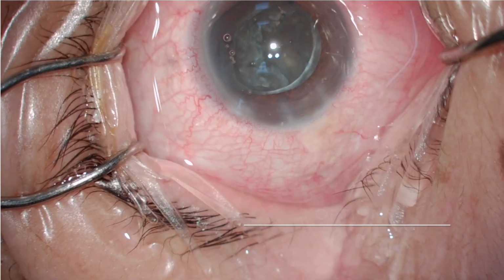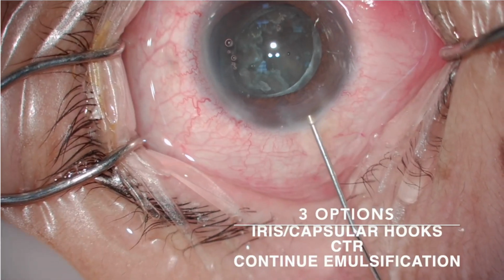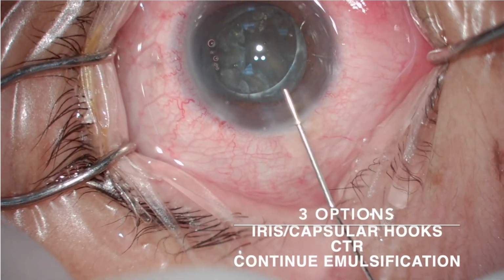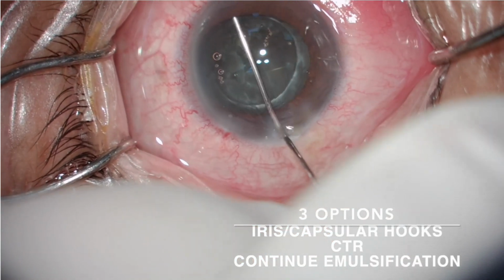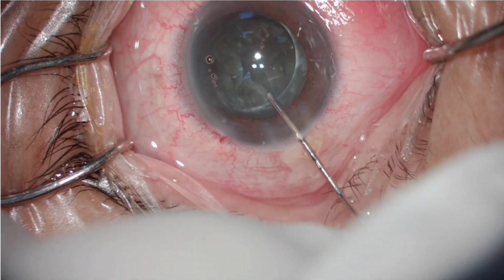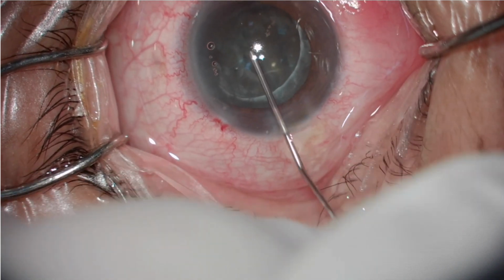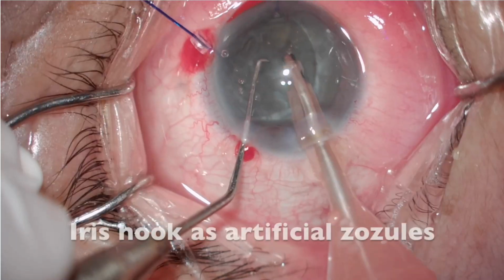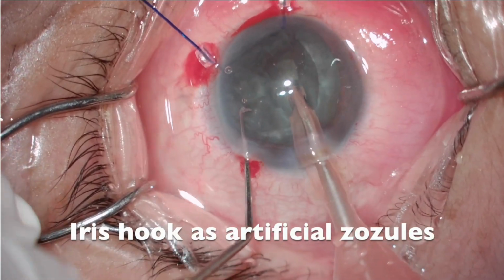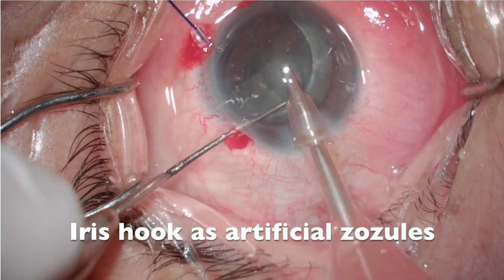Now I have 3 options. First, use iris hooks or capsular hooks. Second, use a capsular tension ring. Or continue emulsification. I don't have capsular hooks in my hand, so I decide to use iris retractors. I fill the anterior chamber and subcapsular area with OVD. I use 2 iris retractors to capture the capsule at the nasal area.